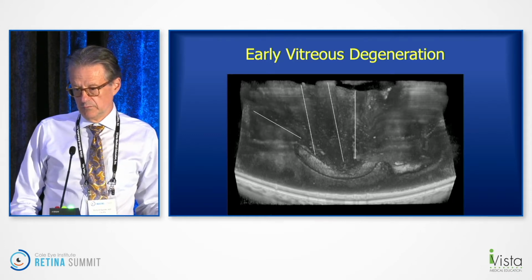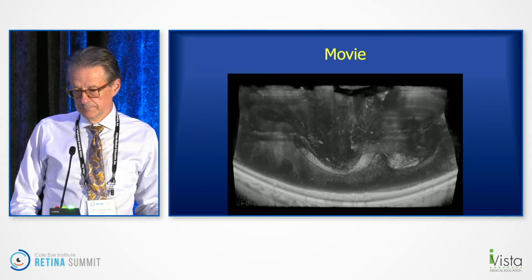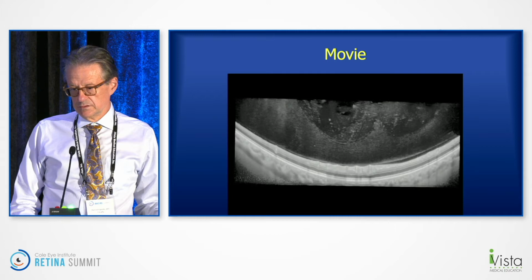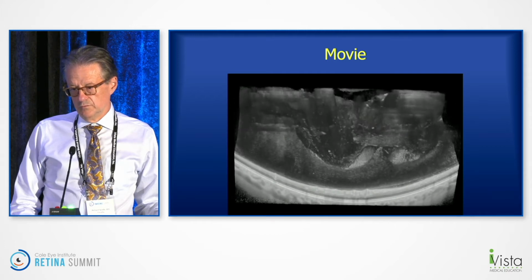We're having a hard time waiting for the next slide, apparently. You can see they're ridges, and in between those ridges, the vitreous is starting to liquefy. There's a little movie of that.